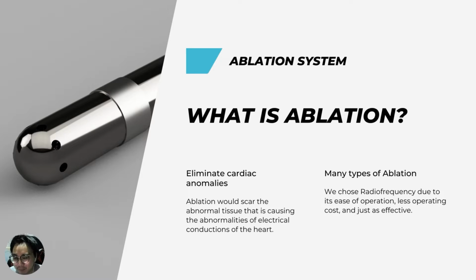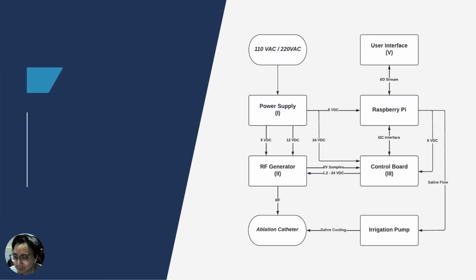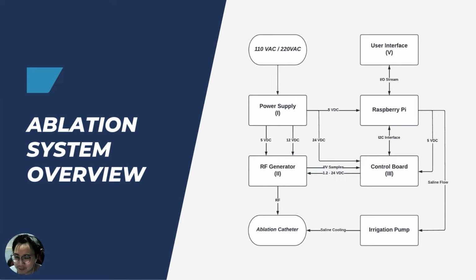There are many types of ablations: cryoablation, laser-based, but in our case, our system would utilize the design of radiofrequency ablation. This is chosen since it is the most cost-effective method and just as effective as other methods as well, based on price.